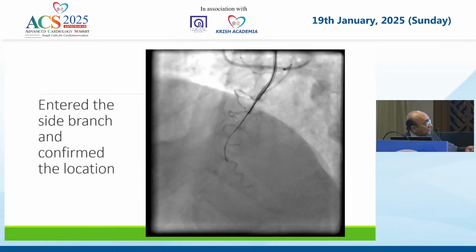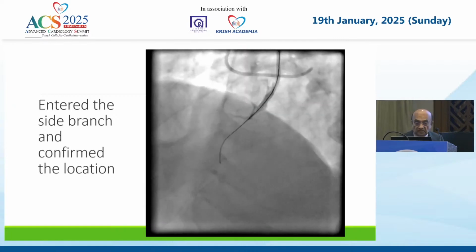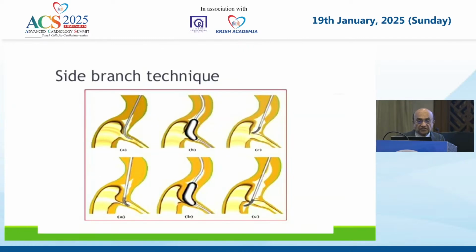When you dilate the side branch at the level of the fibrous cap, the distal entry point, there is a dissection there. The side branch technique, illustrated here diagrammatically, creates a dissection which can then become a penetrating point in the target artery in its distal segment. This is called the side branch technique. One can profitably use this technique where it is available, and where the distal main branch segment is difficult to enter.